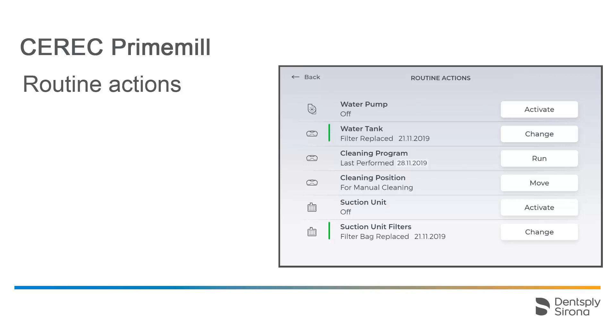From this sub-menu, it is possible, for example, to activate and deactivate the water pump and the suction unit. Information about the status of the water tank and the suction unit filters is displayed. Cleaning the chamber and the prior positioning of the motors and the block axis can be enabled here too.